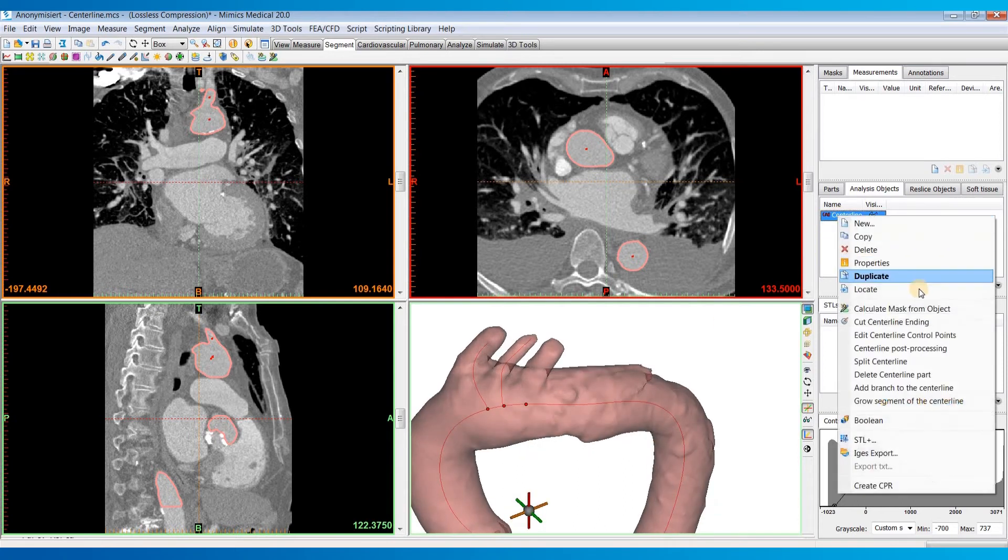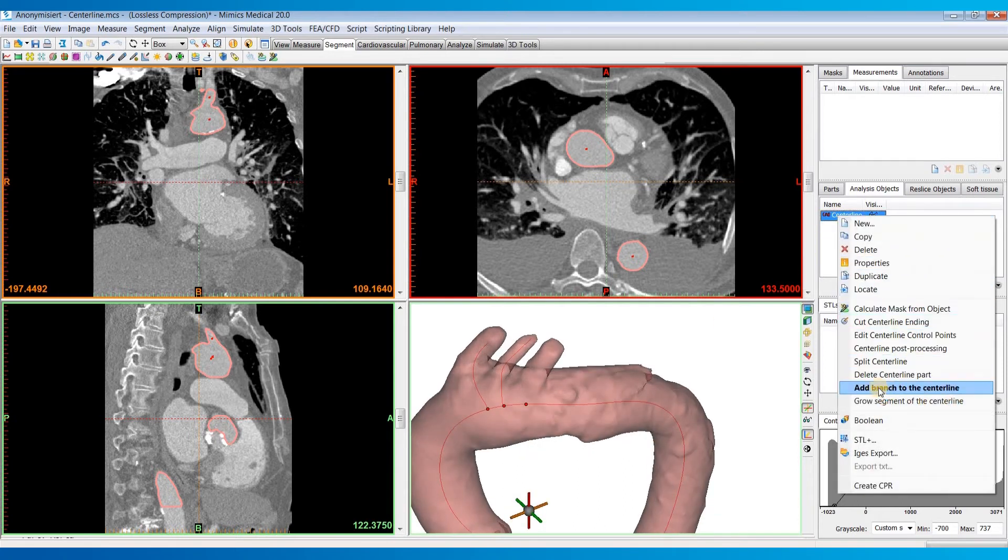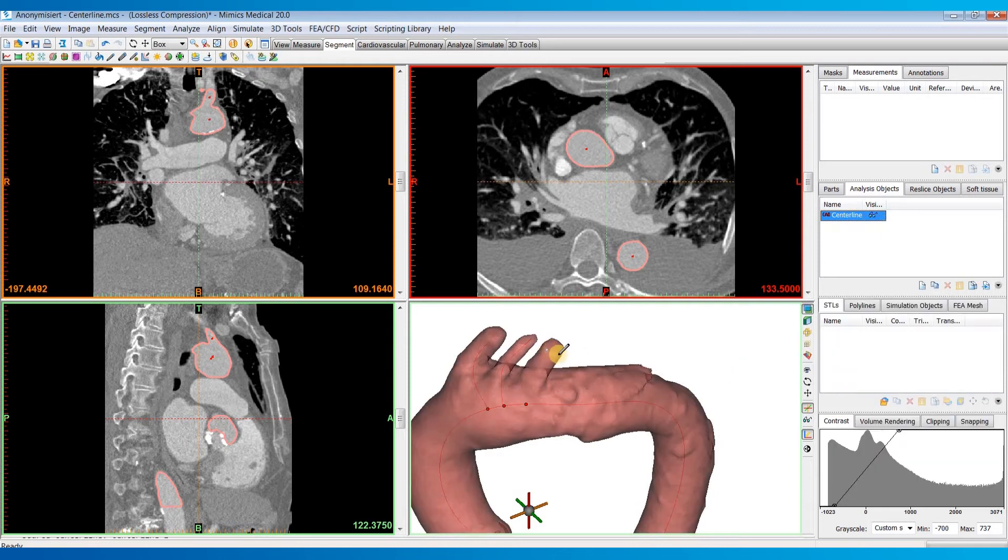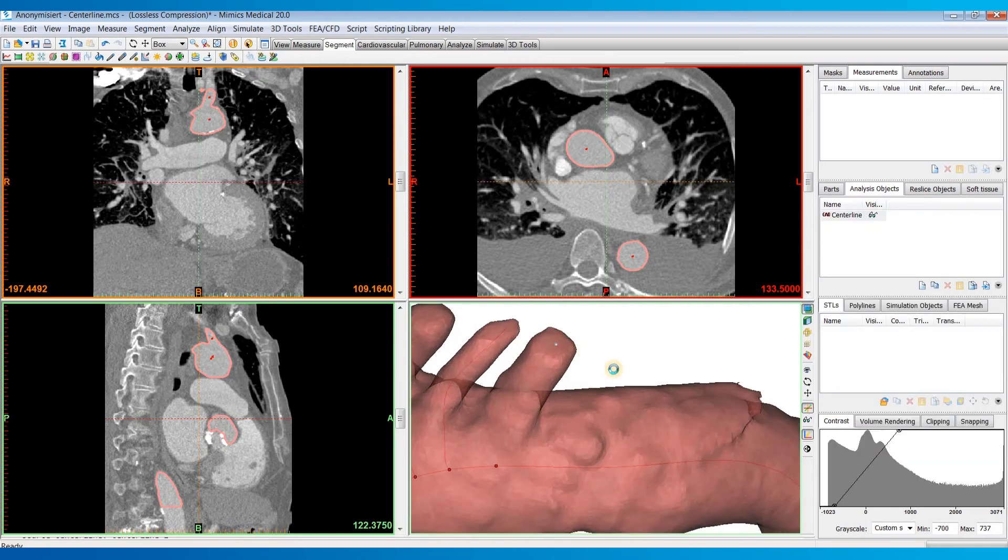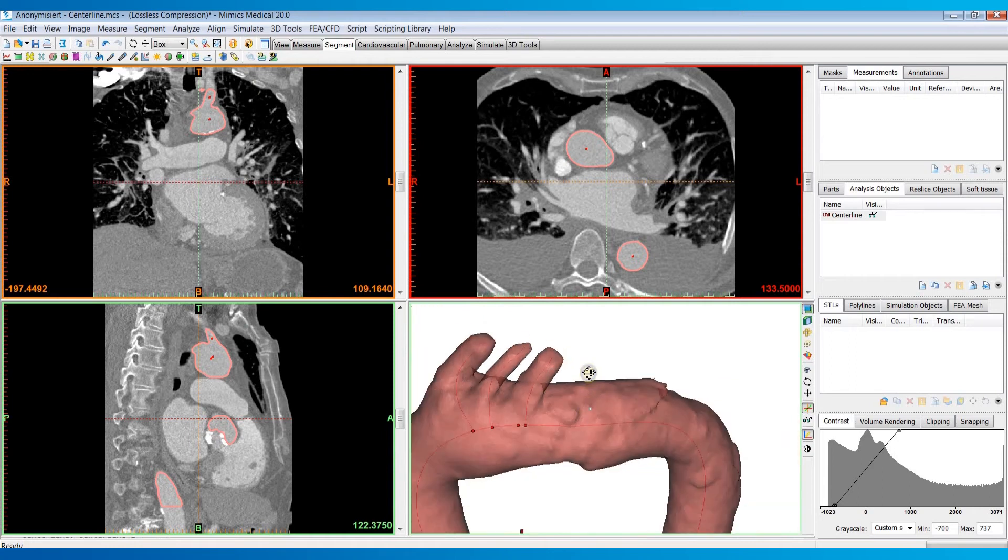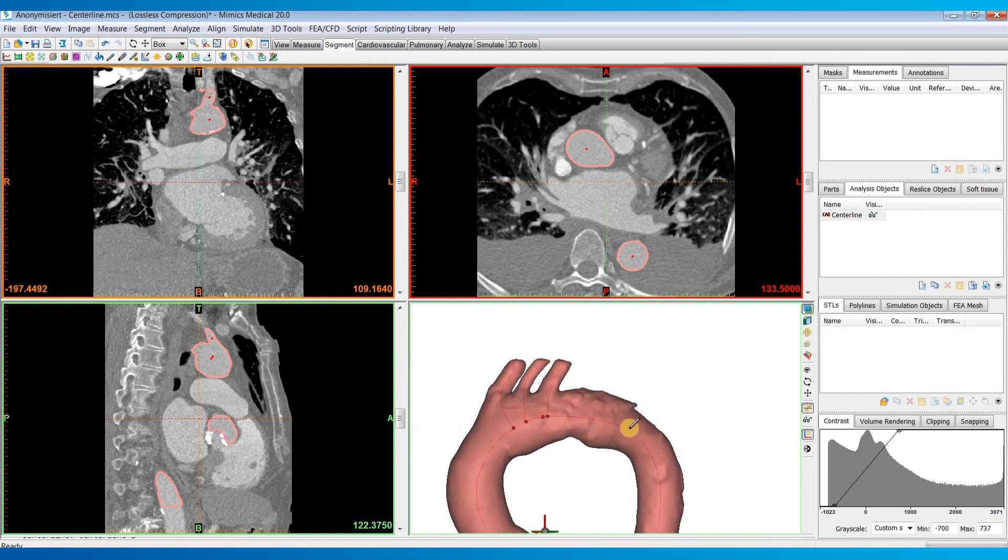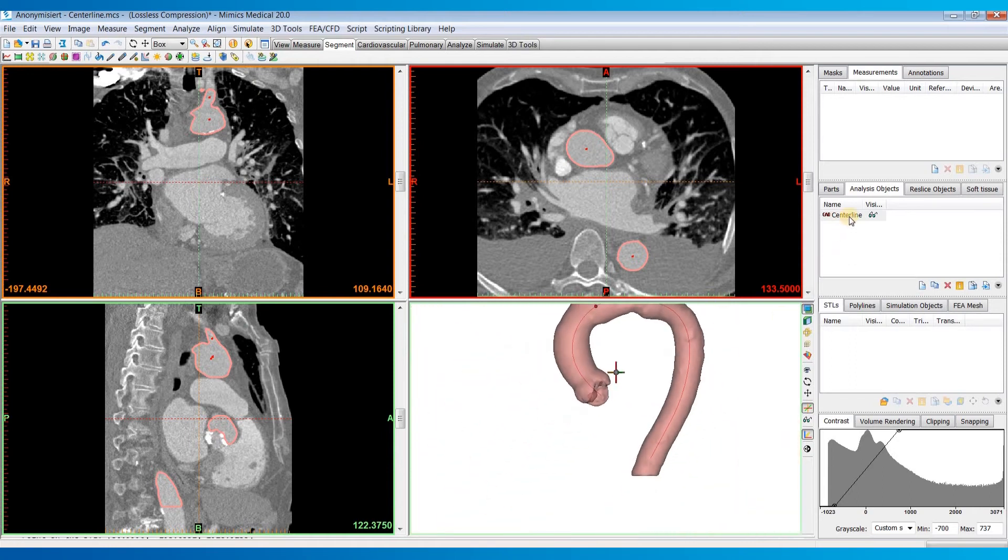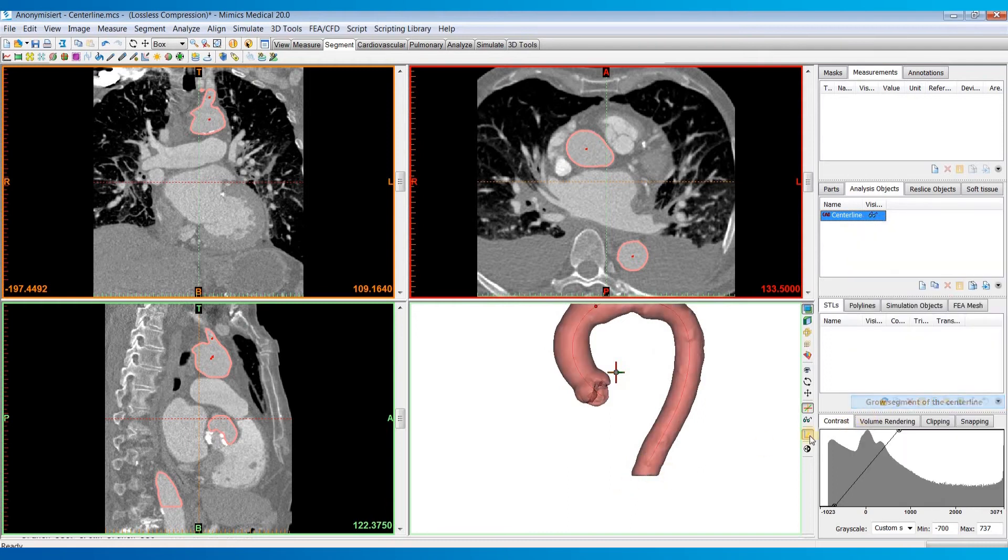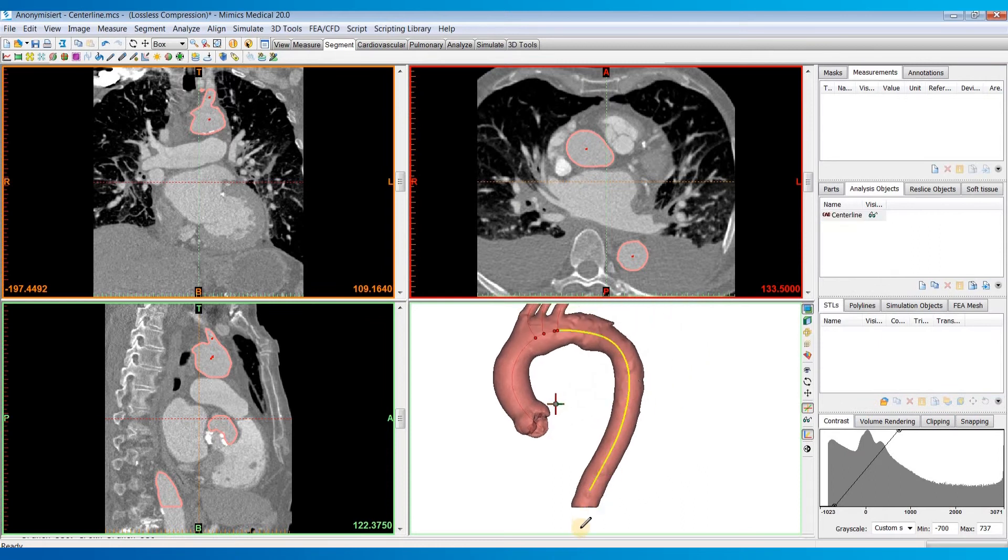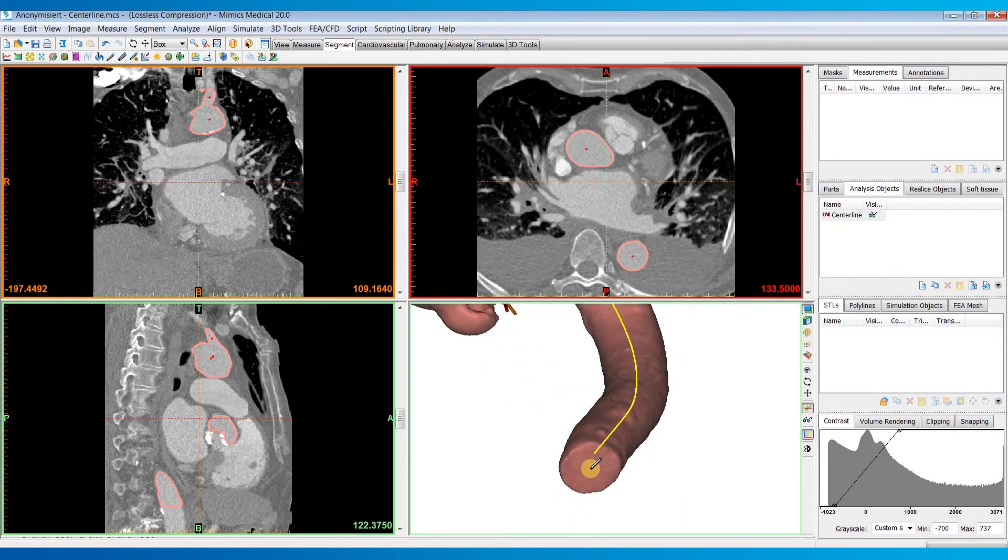If you want to add a branch back in, you could do add branch to centerline. And then just click an endpoint of that branch. And it will recalculate that centerline part for you. Other things you can do are grow a segment of the centerline. Maybe it didn't go all the way through the vessel. You could just click on that segment and then pick a point for it to grow to.